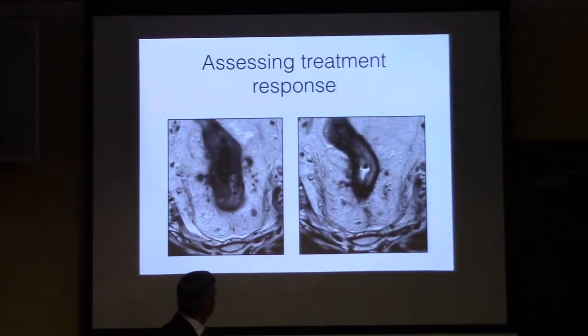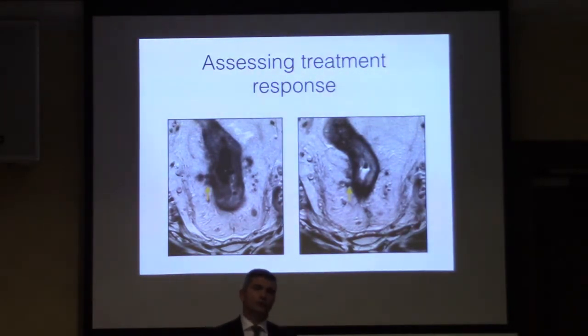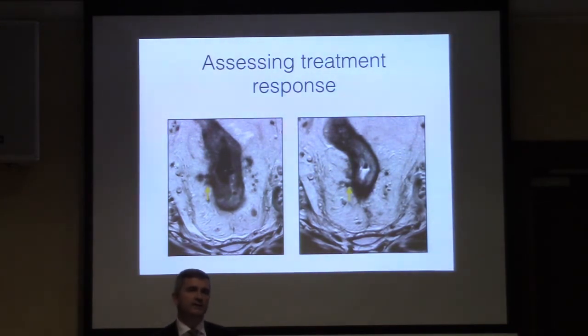Extramural vascular invasion, again, on the same patient, you can see the bulky lump there, which has now become low signal, so it's fibrotic. It does create a little bit of an issue. How do you stage that? And what degree of confidence can you say there's no viable tumour left in there? If it is really genuinely uniformly low signal intensity, then you can say, well, that's tumour fibrosis, and I don't think there's any left behind. But it can be difficult.